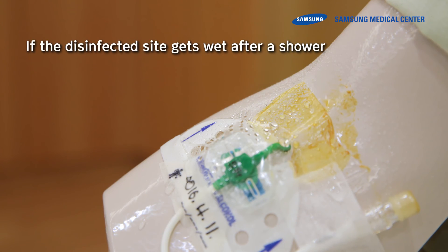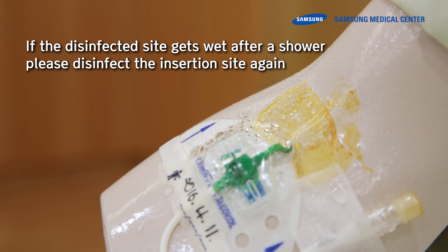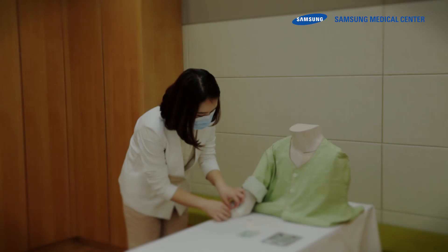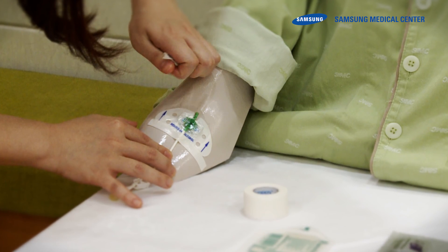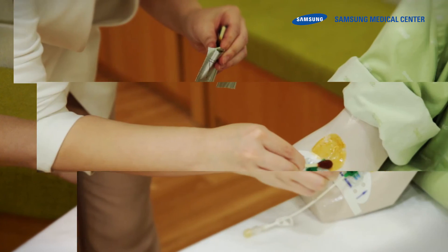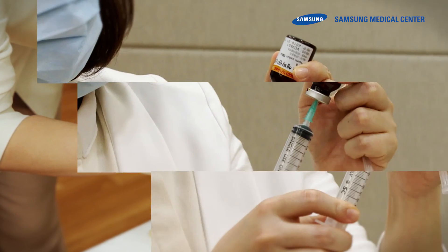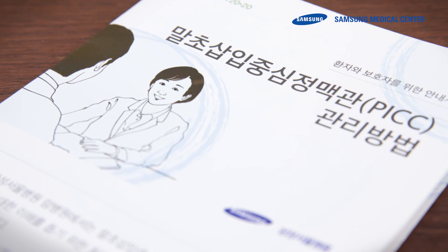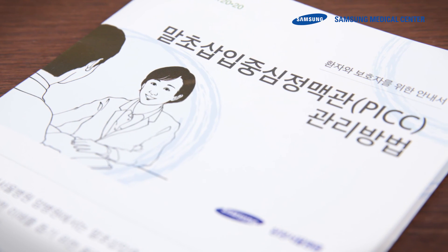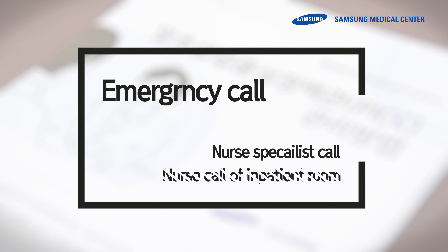Check whether or not water has entered. If the disinfected site gets wet after a shower, please disinfect the insertion site again. We have reviewed how to care for the peripherally inserted central catheters. If you take care of the PICC properly, you can use it safely and conveniently. Please consult the guidebook for patients and caregivers. If you have any questions, please contact the nurse rooms for patients specialized in tumor or general ward nurse rooms.